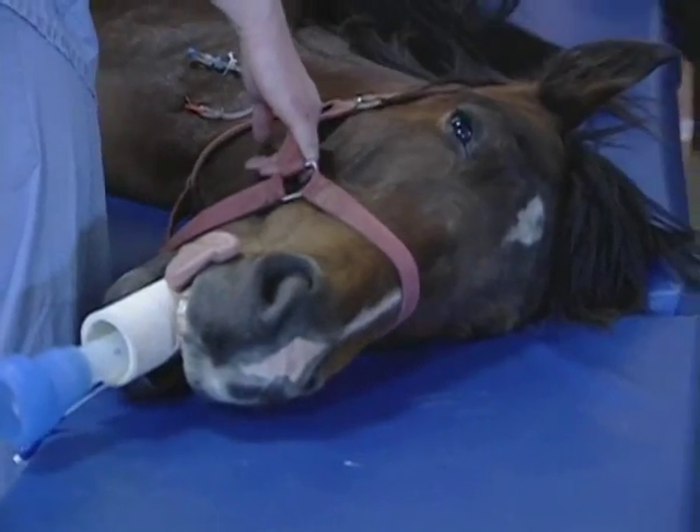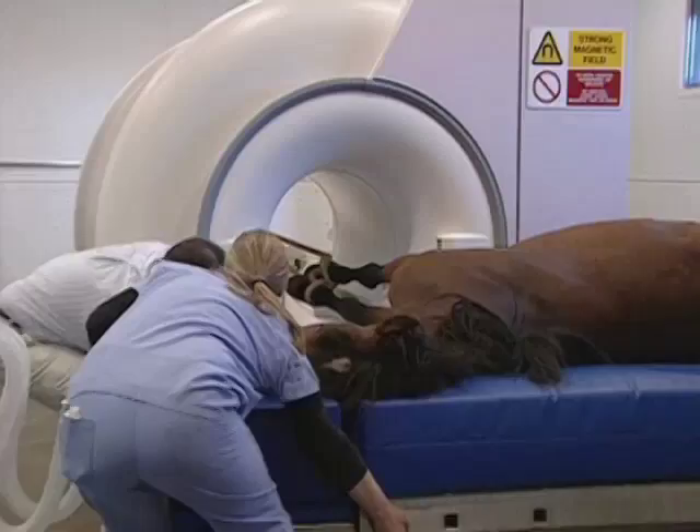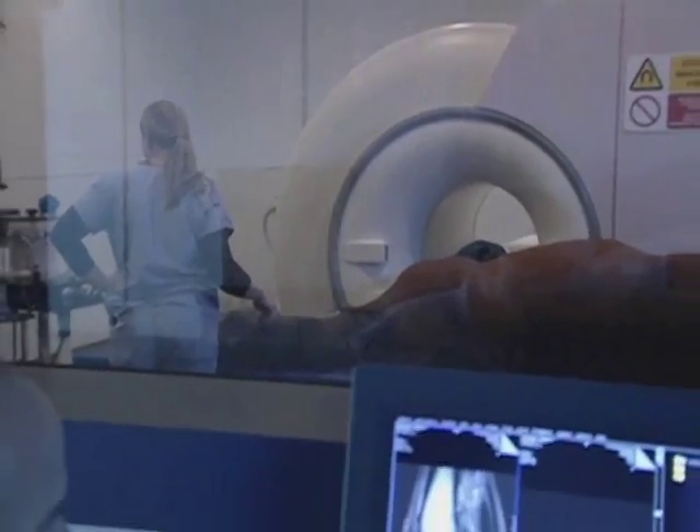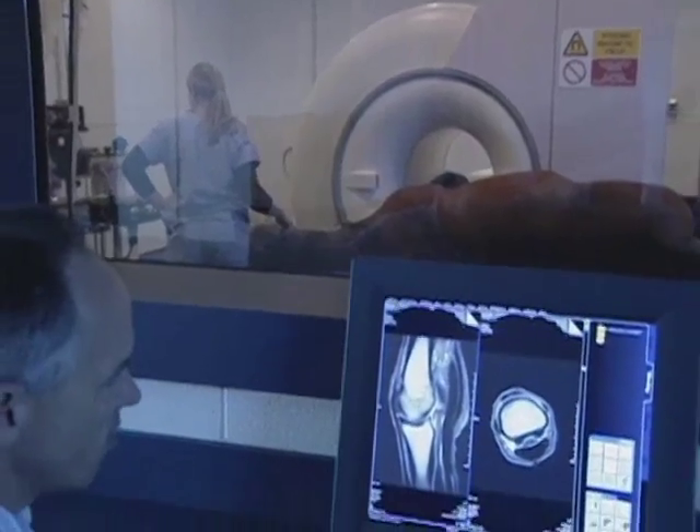The horse's hoof is placed on a table and then placed in the MRI scanner. We can do knees down and hocks down in adult horses, plus their heads. The smaller the horse, the more we can view. The MRI will show us both bone and soft tissue to a detail that we've never seen before.